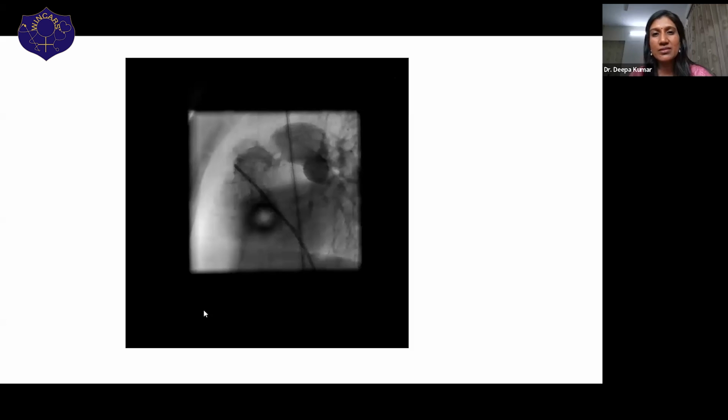What I meant to show was that it is a very thick and dysplastic valve. You see that it is not at all doming, it is kind of stuck onto the annulus. The valve leaflets are not at all moving, and you see the thickness of the valve when compared to the previous one that I showed, where you had very thin, pliable doming valves. This valve is not at all doming. In fact, it is hardly moving. It's a very dysplastic pulmonary valve.